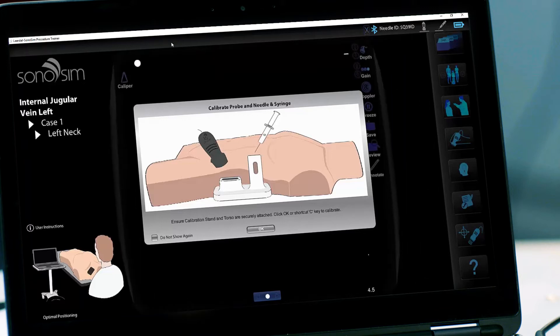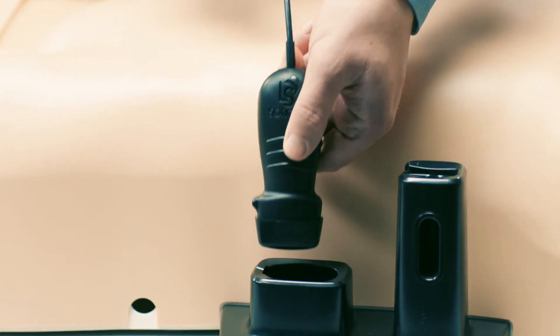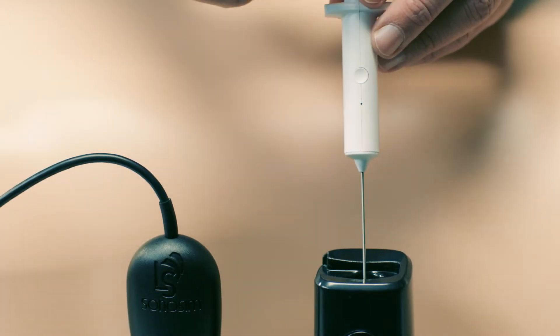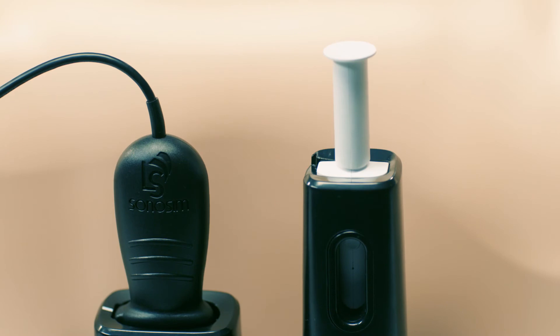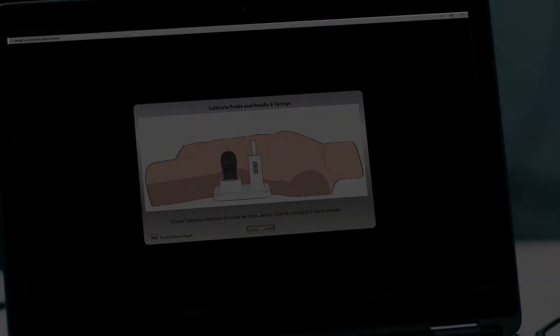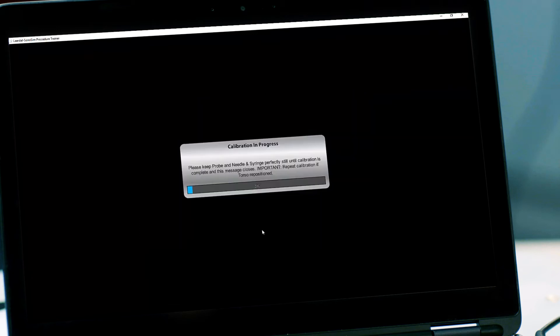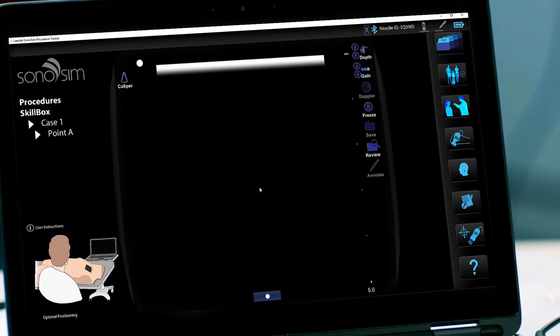To calibrate, place the Leradol Sonosim Probe in the calibration stand with the probe indicator towards the legs of the torso. Next, place the Leradol Sonosim needle and syringe in the stand with the button facing outward. Click OK or press C or Enter on the keyboard to calibrate. Note that if you move the torso after calibration, you must recalibrate the system before performing the procedure.